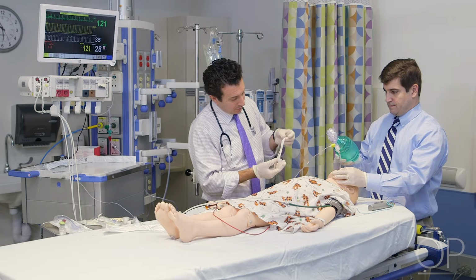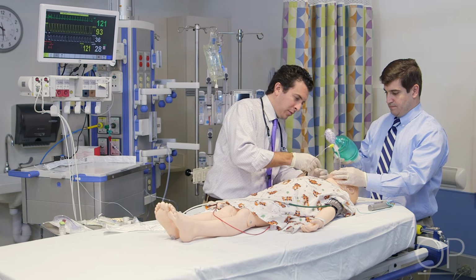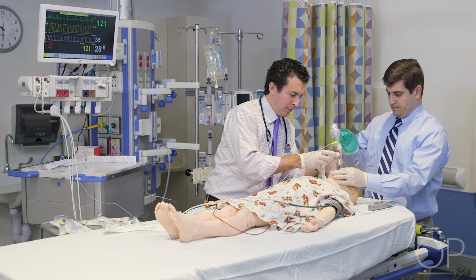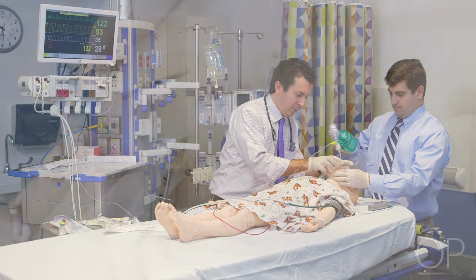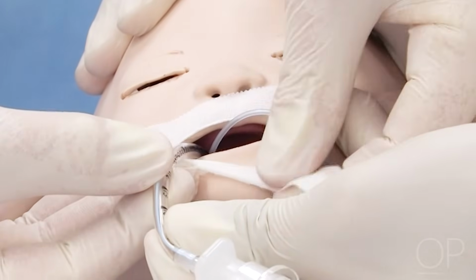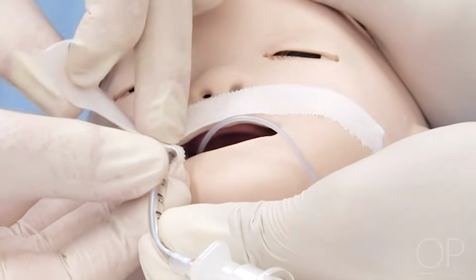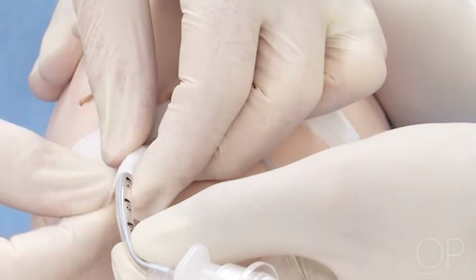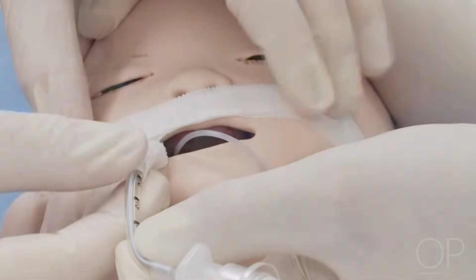Once proper endotracheal tube position has been confirmed, the endotracheal tube should be secured in position using a commercial endotracheal tube securing device or tape according to local practice. While the endotracheal tube is being secured, the provider who performed the intubation should continue to hold the endotracheal tube in place using their thumb and index finger.